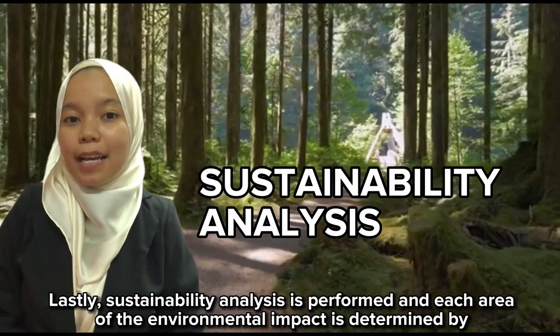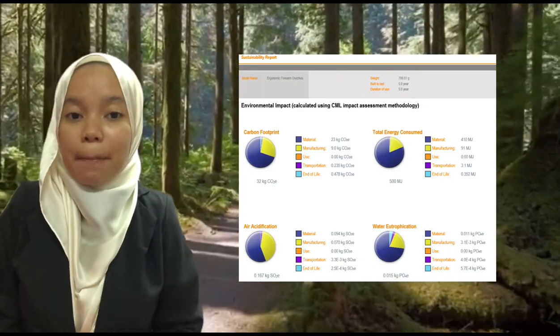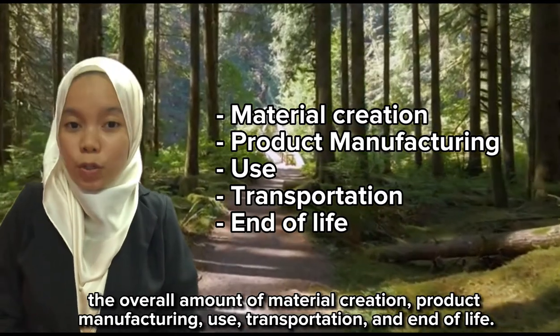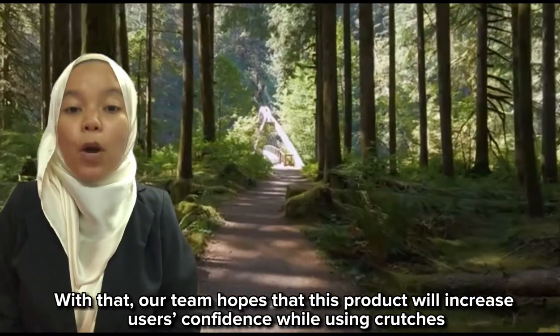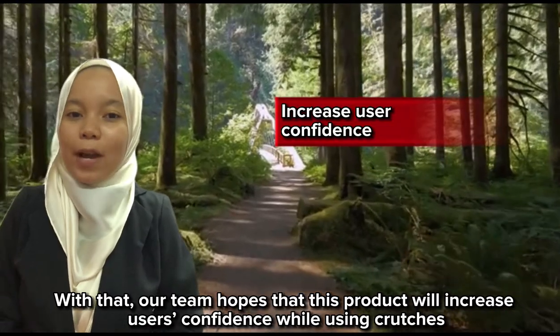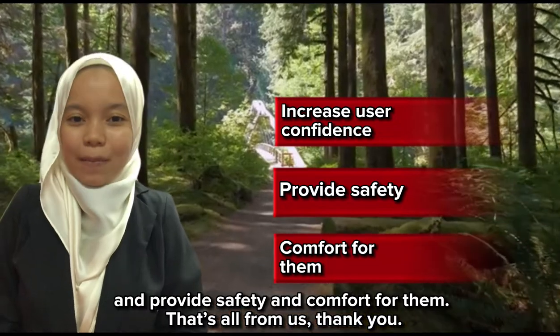Lastly, a sustainability analysis is performed, and each area of environmental impact is determined by the overall amount of material creation, product manufacturing, use, transportation, and end of life. With that, our team hopes that this product will increase users' confidence while using crutches and provide safety and comfort for them. Thank you!